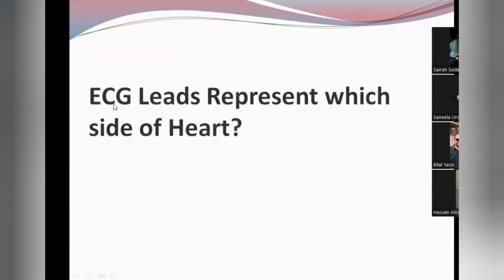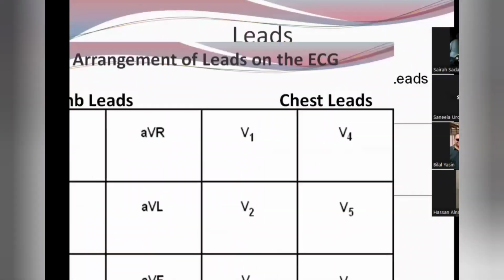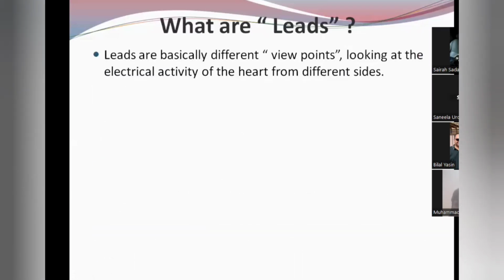Moving on, ECG leads represent which side of the heart? First of all, you should know what a lead actually is. Okay, first let me tell you what the leads are. Leads are basically different viewpoints looking at the electrical activity of the heart from different sides.